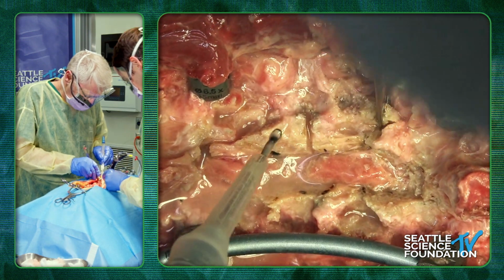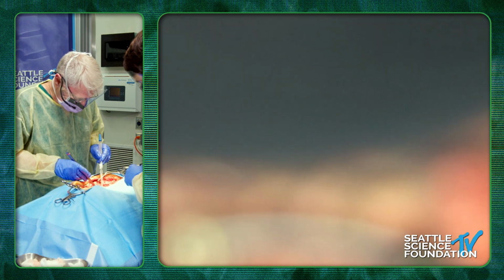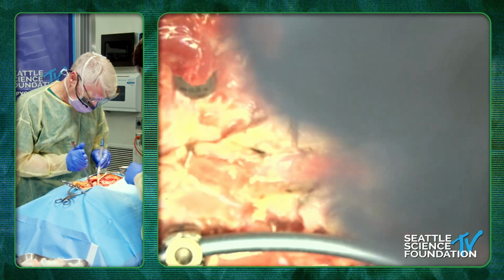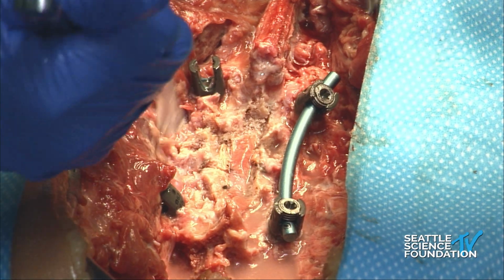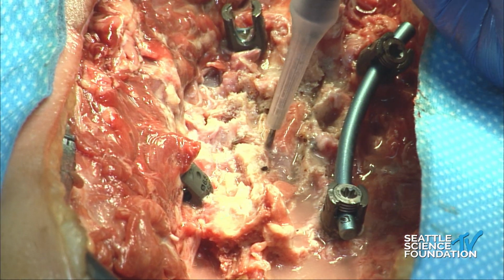Okay, so now we're going to take out these bones. So right now the pedicle is going to be isolated from the bony attachments here. Are you through here? We'll use this. You got it?